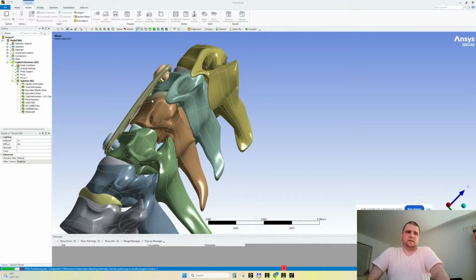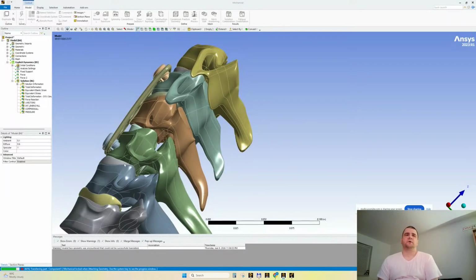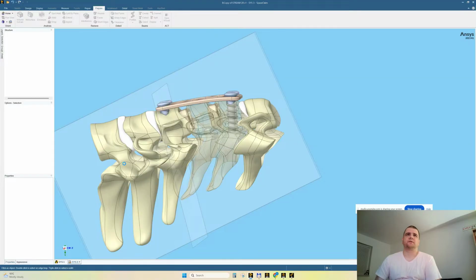At this percentage, I have seen that it takes more time. When having body interactions instead of contacts, everything is kept as needed, while having contacts upon refreshing the geometry, it's heavily modifying the contacts, let's say. So it will be better with the body interaction.